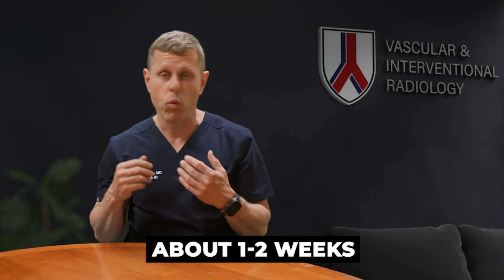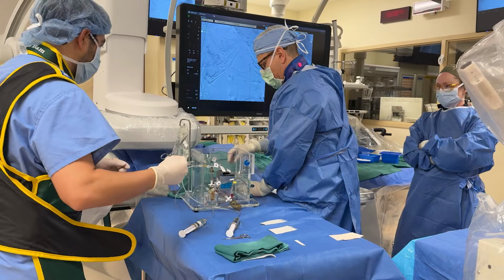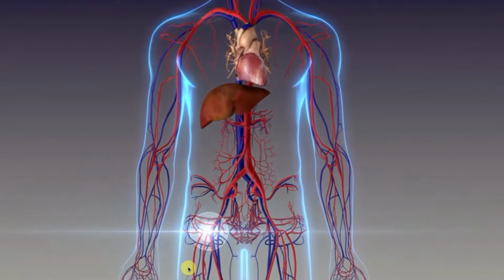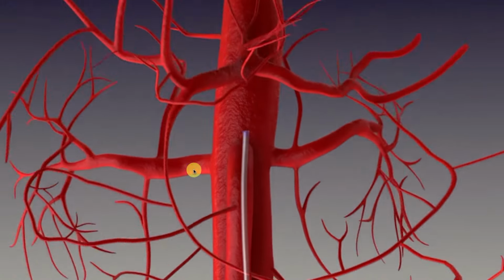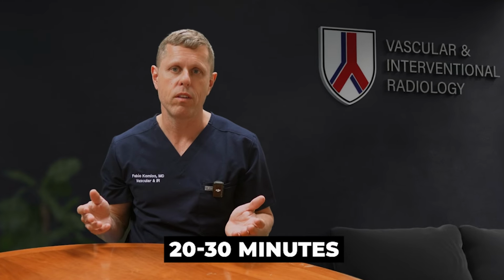Then it comes to step 3, which is the treatment. About 1 to 2 weeks after the mapping, you return for the actual treatment. And at that time, we already know exactly what we're going to do, so it's usually a shorter procedure. And using the same technique, we insert a little catheter in the groin and navigate to the blood vessel where we already planned to treat and will deliver the radiation. The treatment procedure usually takes 20 to 30 minutes and almost everybody will go home the same day.